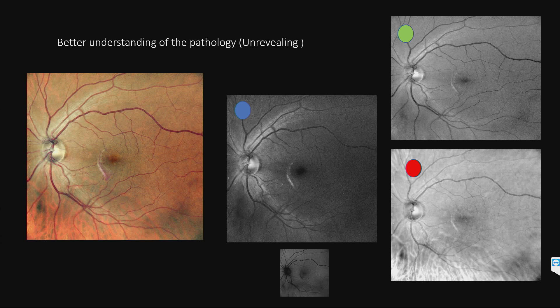Multicolor imaging is sometimes helpful in better understanding of pathology. This patient came with blunt trauma and has a scotoma. At first glance, we make a diagnosis of choroidal rupture, but when you look at the blue, green, and red reflectance, the area of pathology is more markedly seen in the blue reflectance imaging. If it was a pathology of the choroid, it should have been seen in the red reflectance image.